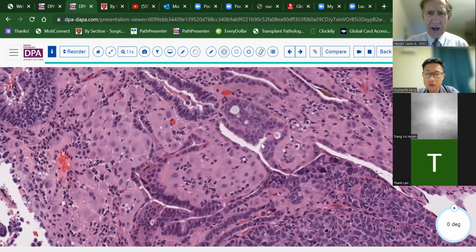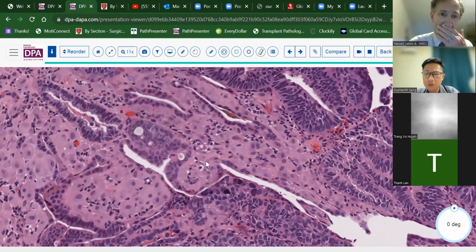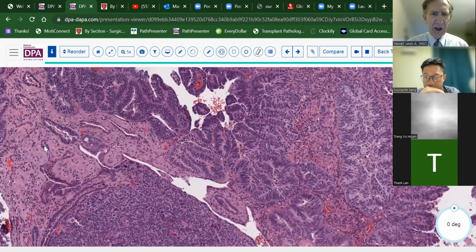But at least in the United States, many times when patients begin to experience postmenopausal bleeding, the gynecologist will prescribe some progestins to help staunch the bleeding until they can get the patient in for a biopsy. And that, in fact, is what was done here. The patient was given some progestins, and the stroma that still remains has become decidualized. And so this is a reaction to the gynecologist's prescription and not part of the tumor. But it's kind of an interesting contrast here.